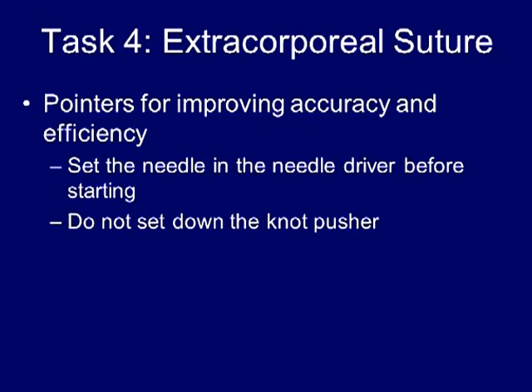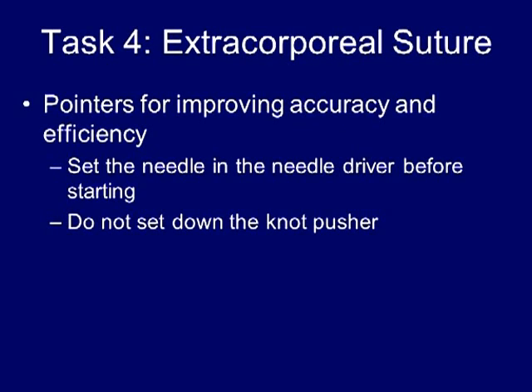In order to improve your efficiency with this exercise, take advantage of the fact that you can set the needle and suture in the needle driver before introducing it into the box in the proper orientation.